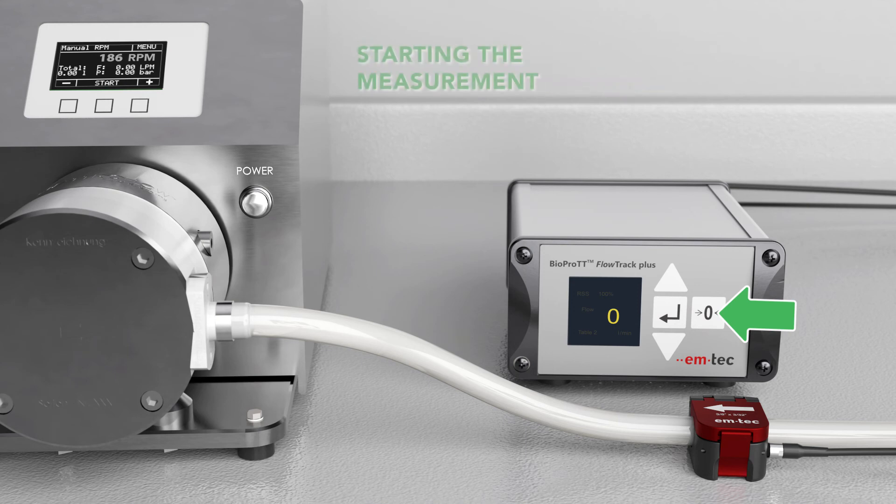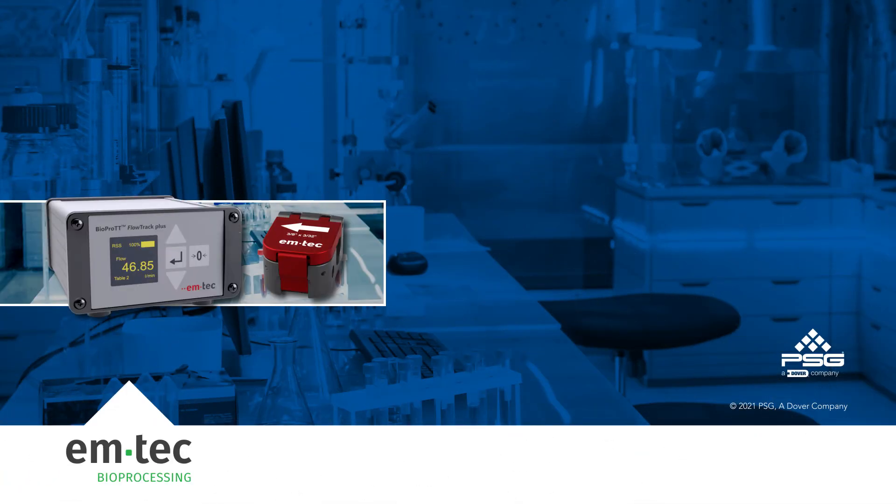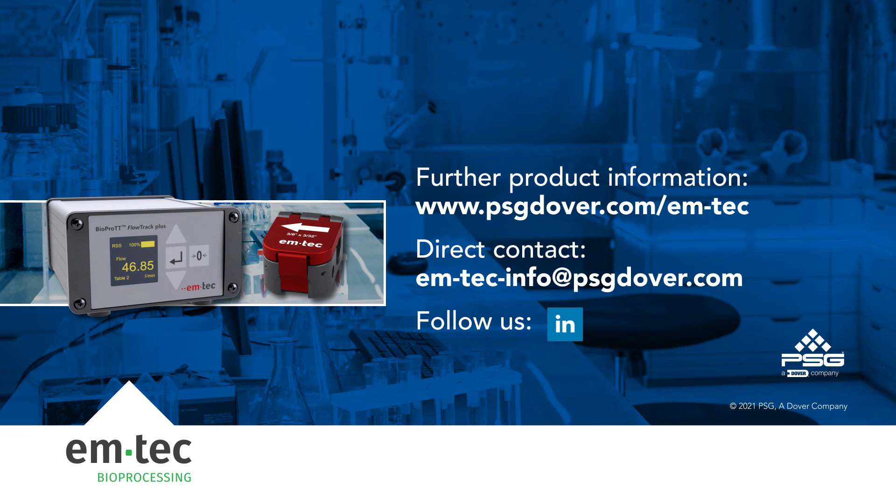Now you can start the measurement by increasing pump speed and benefit from a reliable flow control with the BioPro TT plug-and-play solution. Please feel free to contact us if you have any questions or need additional help with setup. Thank you.